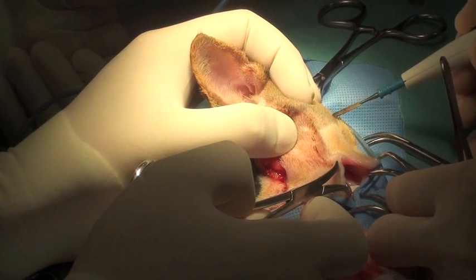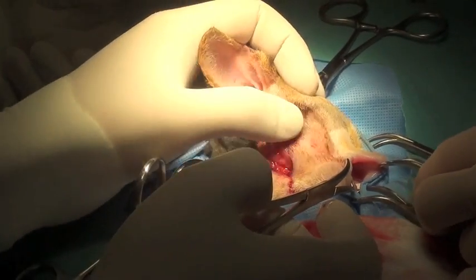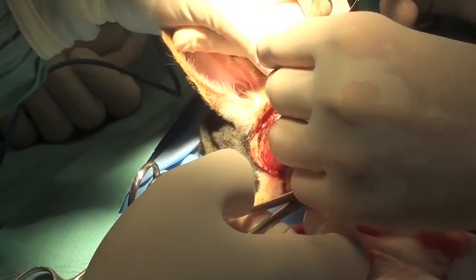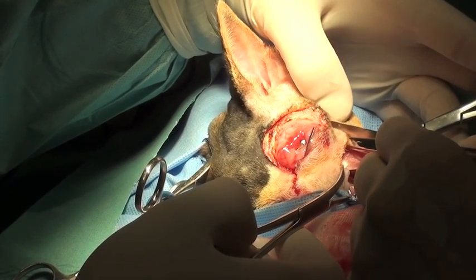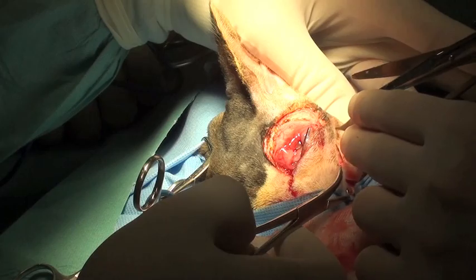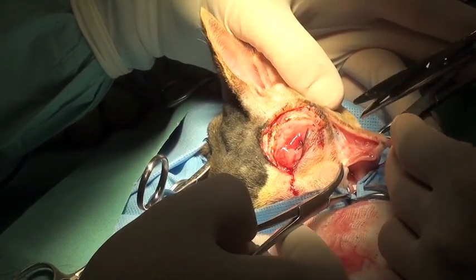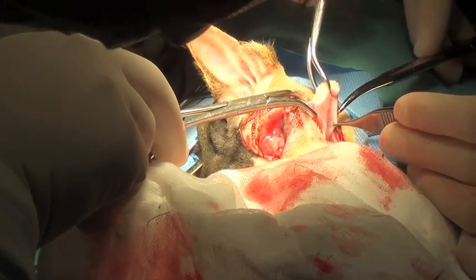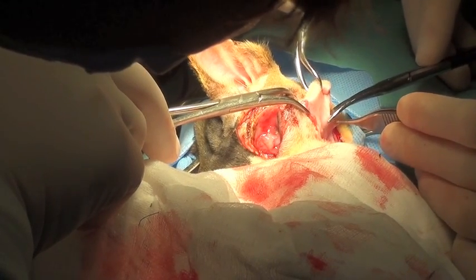The borders of the flap intended for transfer to the upper eyelid are identified using electrocautery. The lip margin is going to be transferred to the dorsal palpebral region in order to reconstruct a mucocutaneous junction. Suture that mucosa to the conjunctiva. Yeah, that's what we're doing.